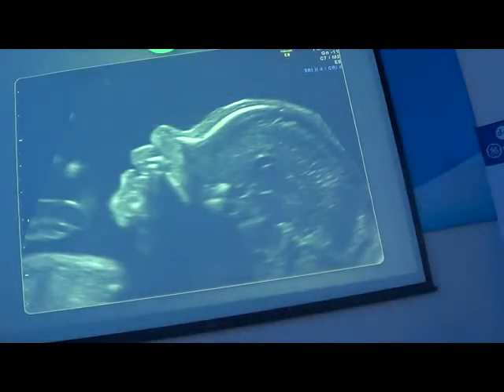Now we move to the second and the third trimester scan, the examination of the face. The main difference between 22 and 32 weeks is that at 22 the examination of the face is easy to do because we have lots of space, but at 32 it's more difficult because sometimes the face is against the placenta without fluid in front. These are face images of the fetus at 22 and 32 weeks. At 22 weeks everything is much easier because there is plenty of amniotic fluid, while at 32 weeks there is less fluid, and it is made difficult by the placenta.